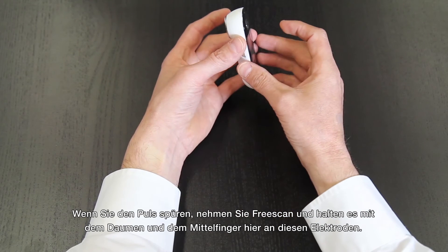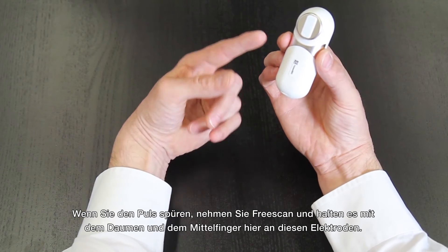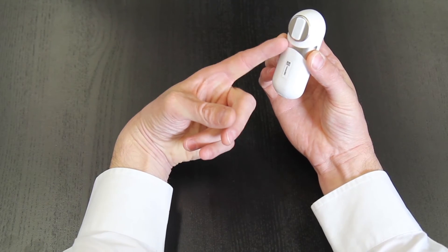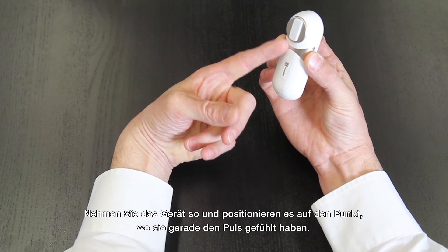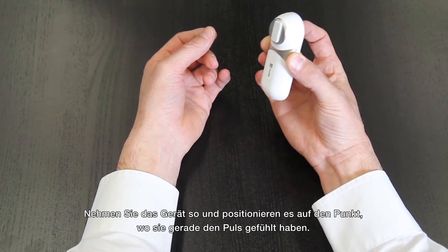take FreeScan and hold it between your thumb and middle finger here on the electrodes. To get a perfect reading, place the device on the same spot where you first felt your pulse.